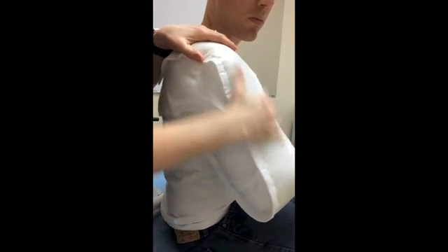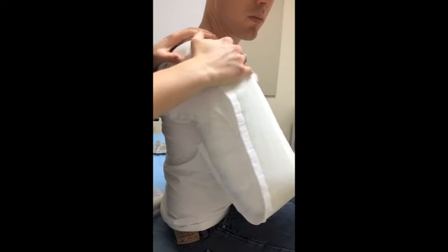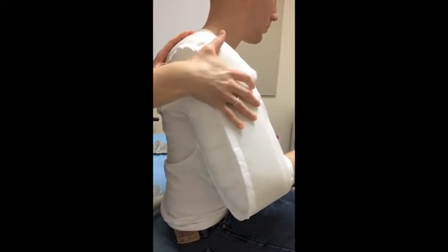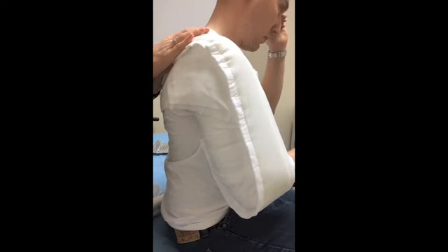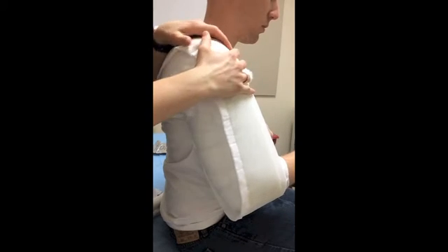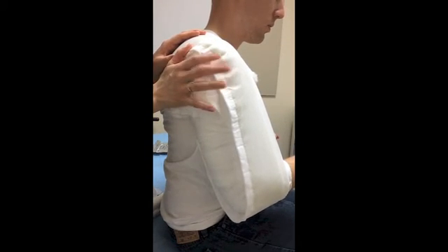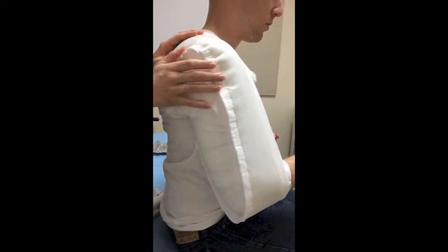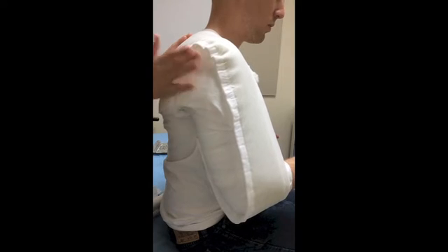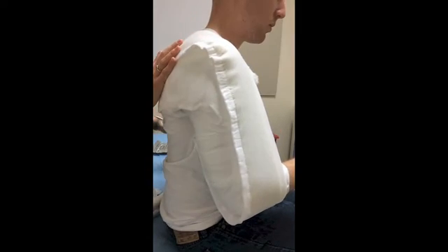When this hardens, it's going to hold them both at that 90-degree angle and keep their shoulder from rising or moving around too much, which is why it's so important that we make sure the shoulder begins in a relaxed position. This is a good splint to get wet on patients who can't tolerate sitting up or sitting still for a very long period of time, because it will speed up that curing process. But for this particular patient, he is able to sit in one place.